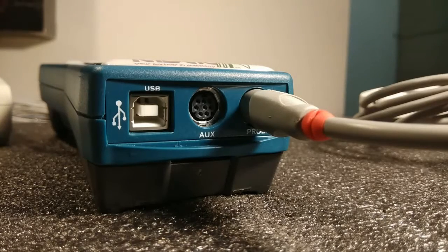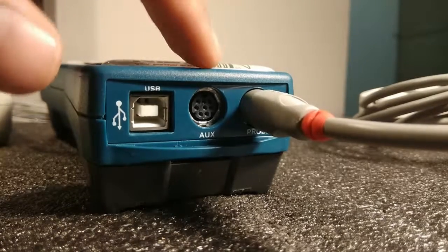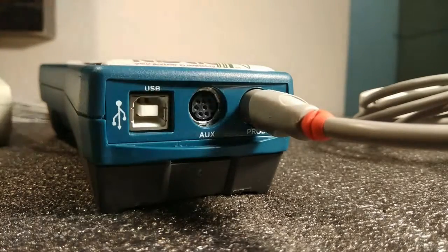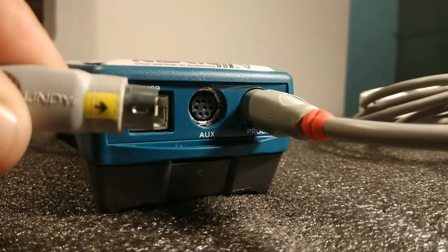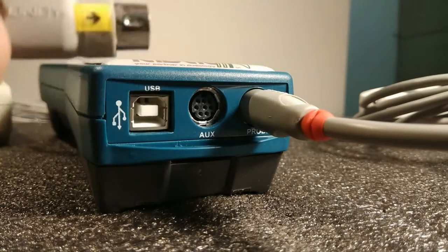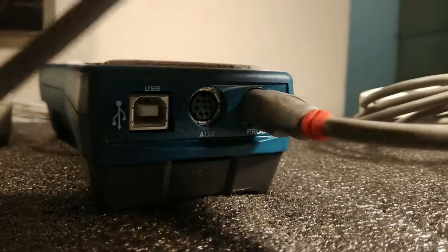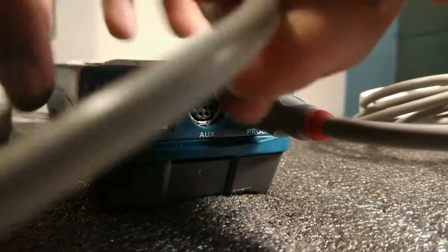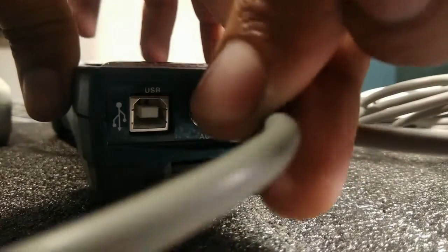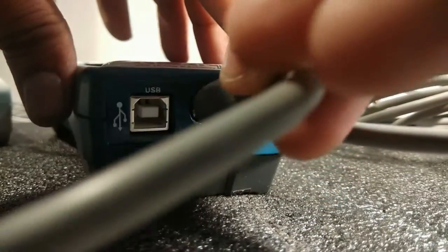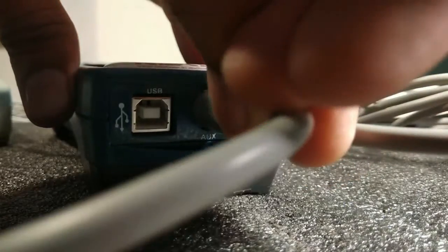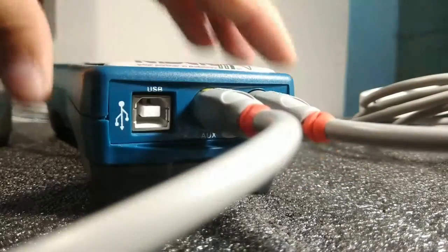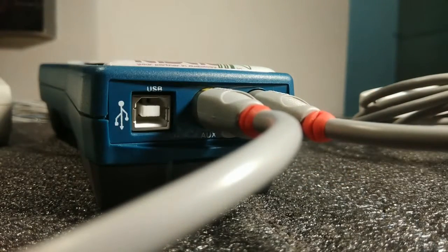Now let's make the connection of the pre-amplifier. The pre-amplifier goes in the aux port. You can see the arrow mark is over here, so keep it upwards and then connect it. So here we have connected the pre-amplifier cable.